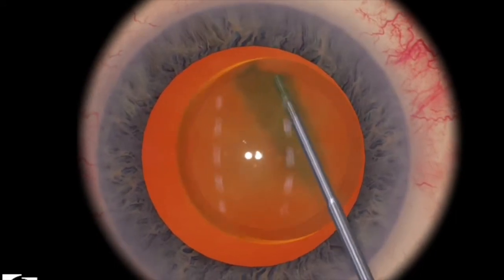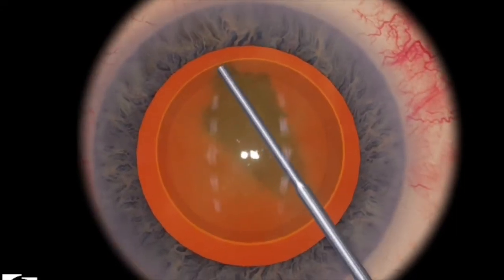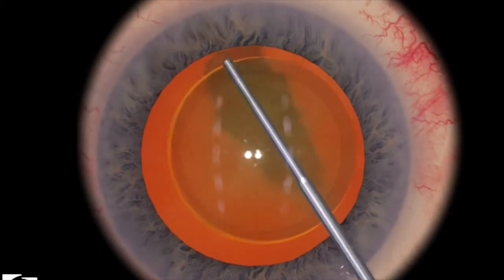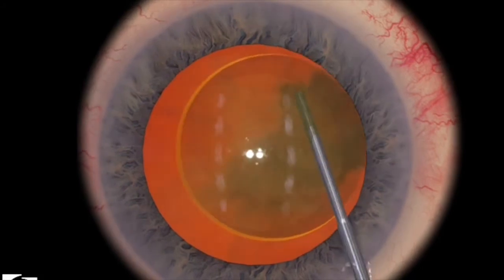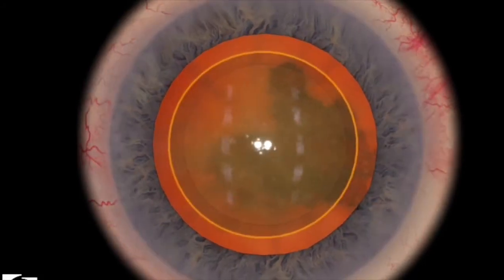First, I'd actually like to perform hydro delineation. The simulator grades you on whether you've hydro delineated appropriately and whether you can move the nucleus in the appropriate manner. That's demonstrated if you look very carefully at the yellow golden ring and then the lens inside the yellow golden ring to actually be able to be highlighted.